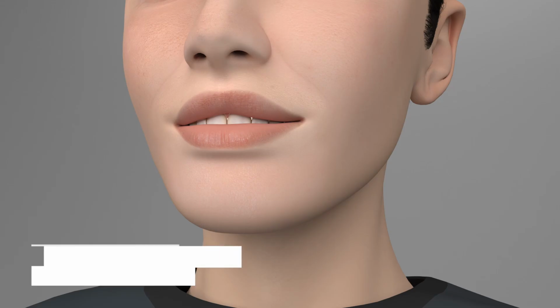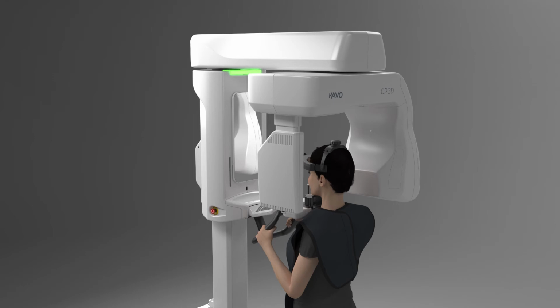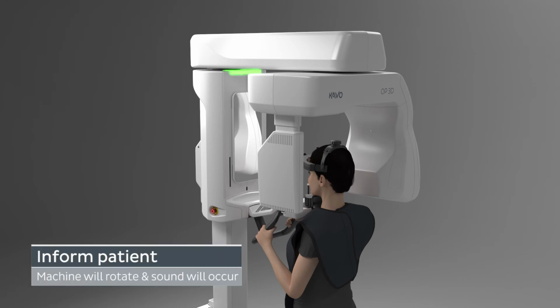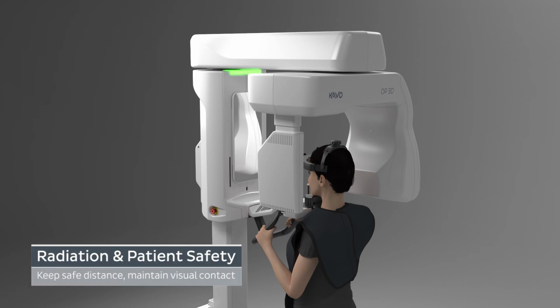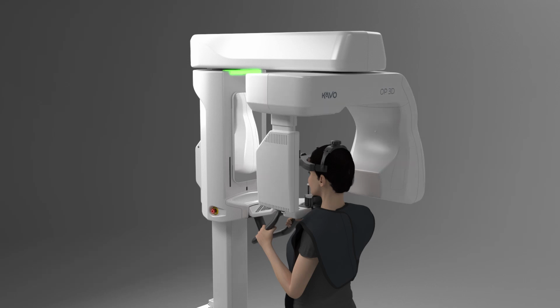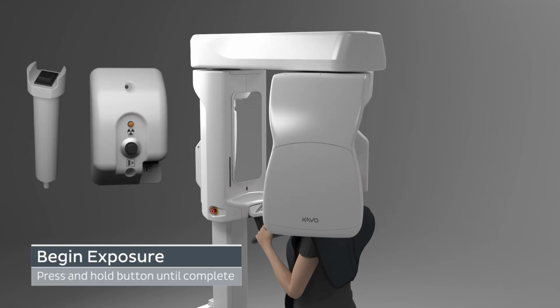Ask the patient to swallow, place the tongue to the roof of the mouth, and remain still for the duration of the exposure. Inform the patient that the machine will rotate around their head and an audible sound will occur. Protect yourself from radiation in accordance with local safety guidelines and regulations while maintaining visual contact with the patient during exposure. Press and hold down the exposure button until the process completes.